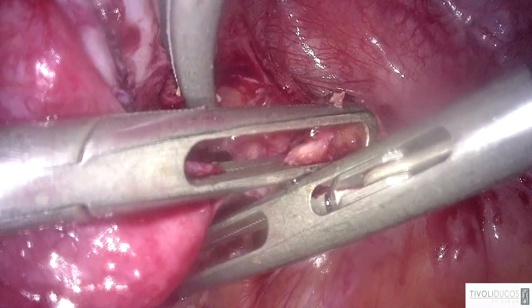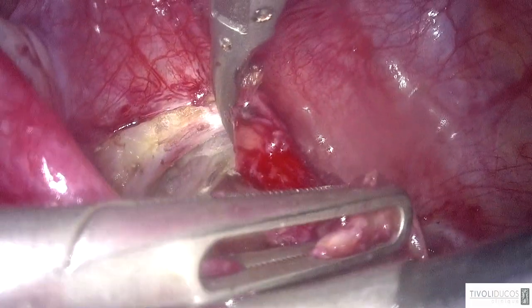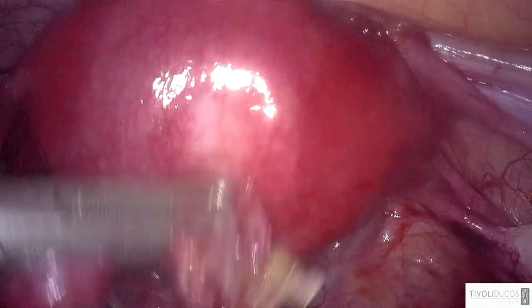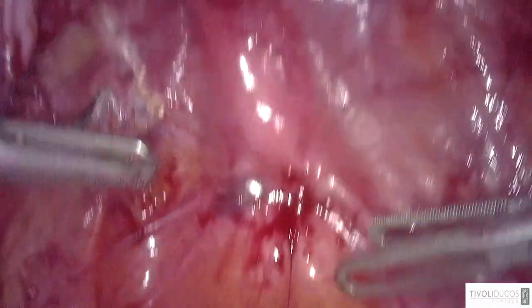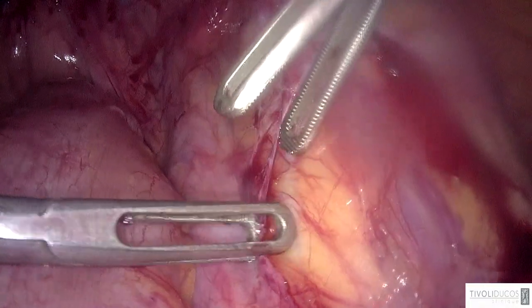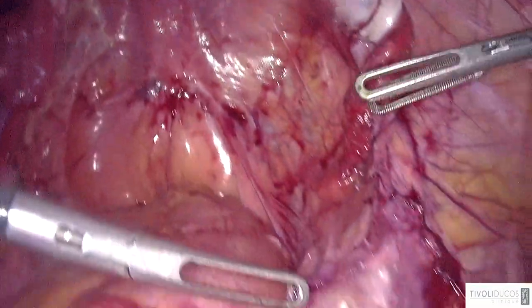which are unknown today. So to carry out the surgery, I hesitated between taking the plasma jet, the harmonic scalpel or the thunderbeat. And ultimately, I chose the harmonic scalpel because of the patient conformation. She has some fat tissue, and plasma jet produces a lot of smoke. Just a moment, Jamil. It produces a lot of smoke on fat tissue. So I decided to take the harmonic scalpel. But the view is not clear, Jamil. Just a moment, excuse us, we'll clean.